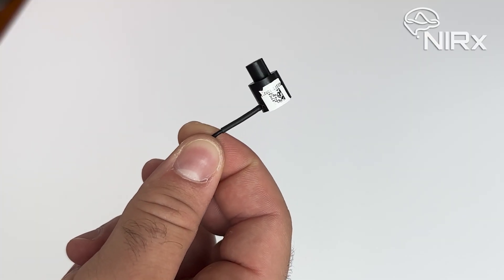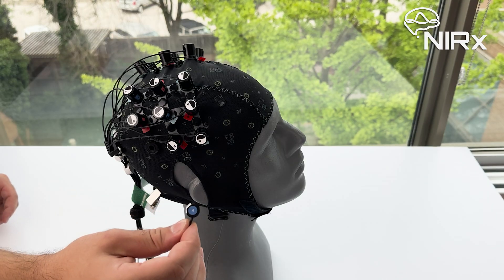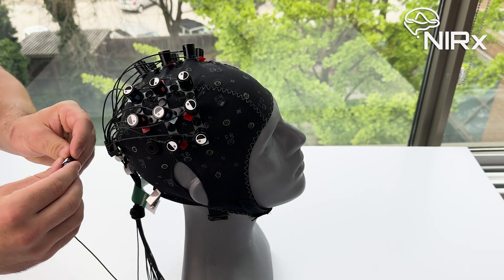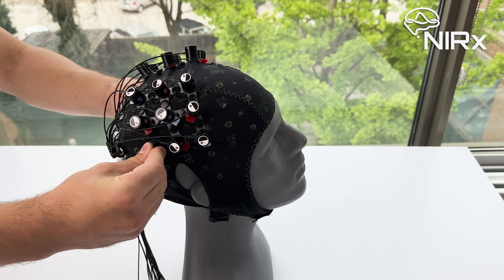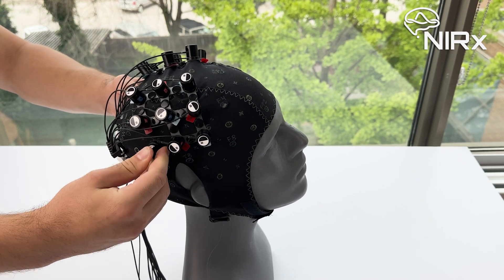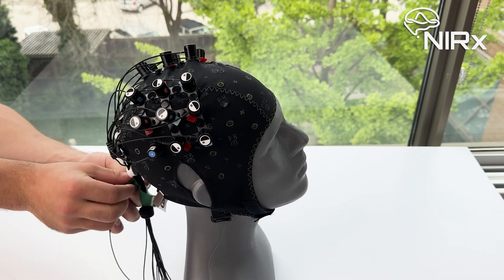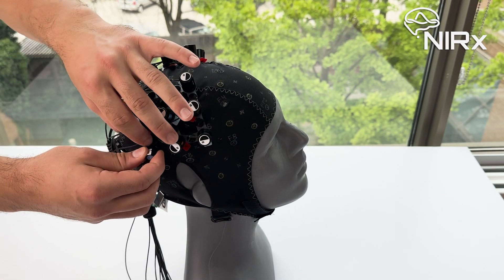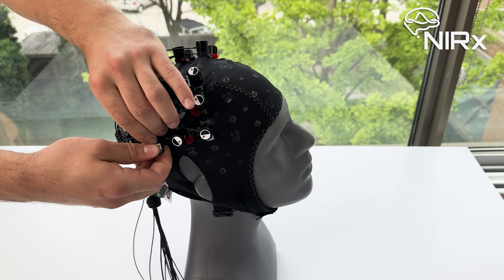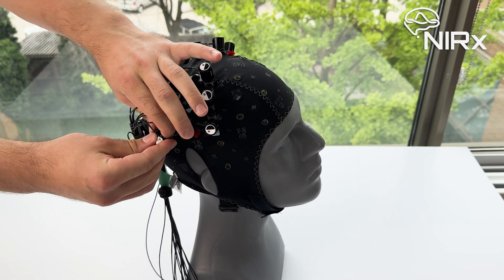Now onto the accelerometer. The accelerometer is attached to the detector bundle — it looks very similar to an optode, but is labeled with an A instead of a number. To install, push the accelerometer into the opening of the AC grommet. If the AC grommet is brand new, it might be a bit tight; in this case, it can help to angle the accelerometer when inserting it. You can then guide the accelerometer cable through the green velcro strap as well. Note that when removing the accelerometer from the cap, you should never pull on the cable, but rather wiggle the head of the accelerometer until it comes loose. This may require just as much force as it did when inserting it.